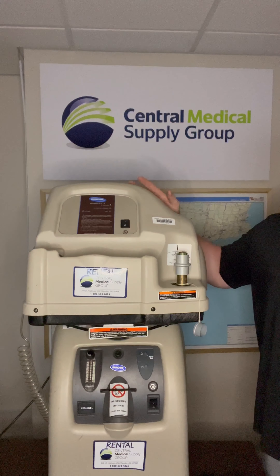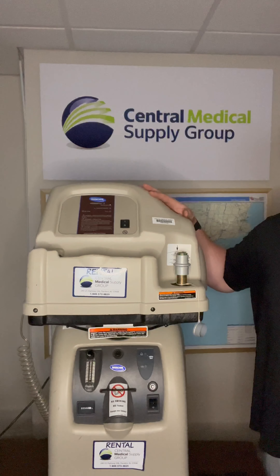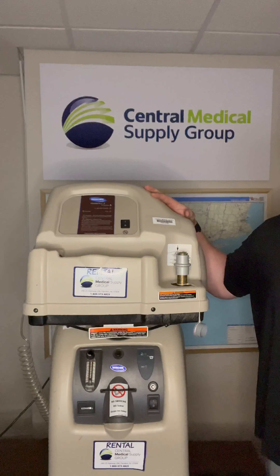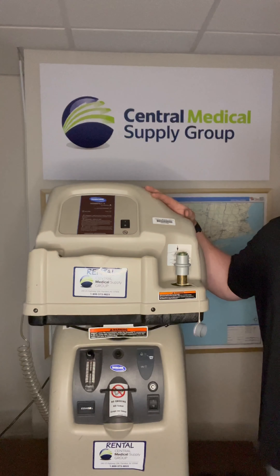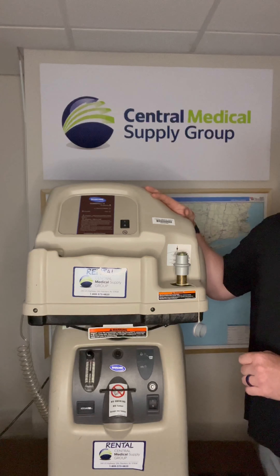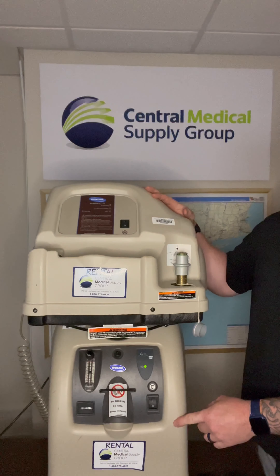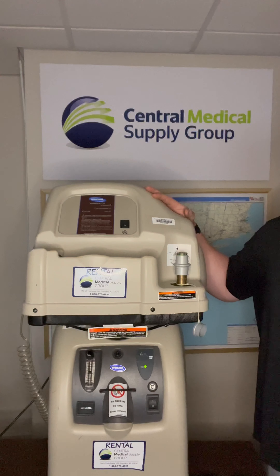When all of your components and cords are connected and plugged into a proper power source, turn on the concentrator by pushing the power button. The unit will make an audible test tone noise momentarily, lights on your panel will illuminate, and you will hear the concentrator start to run. A green light on the front panel indicates that there are no malfunctions — this can take a few minutes to register.